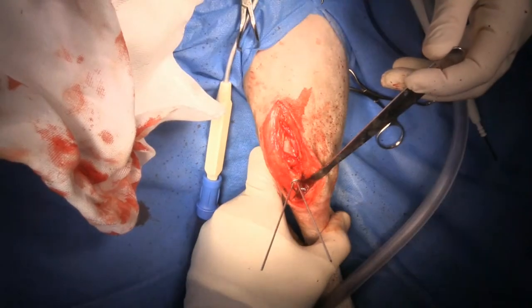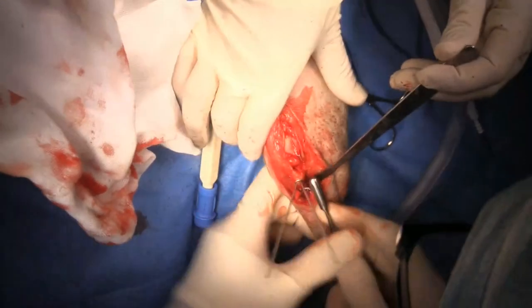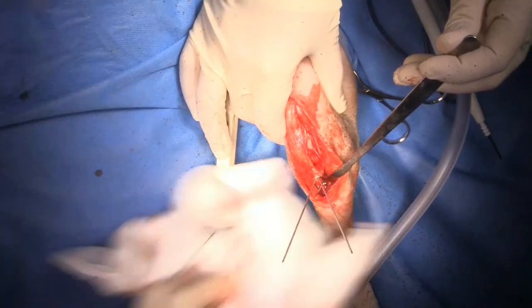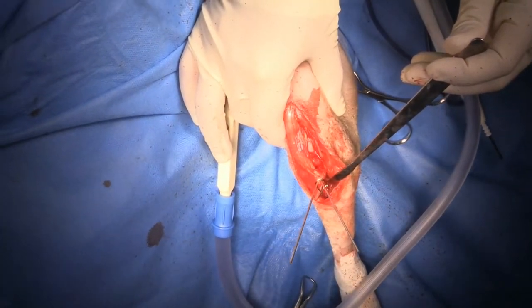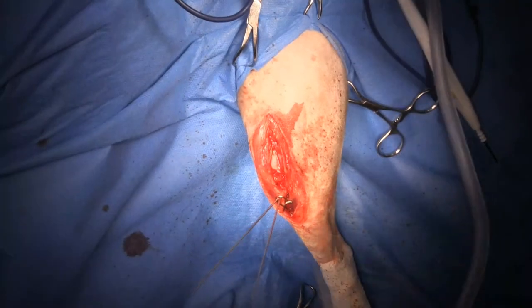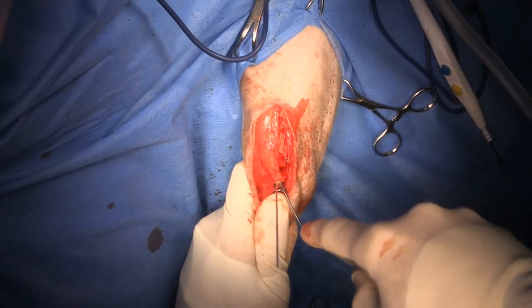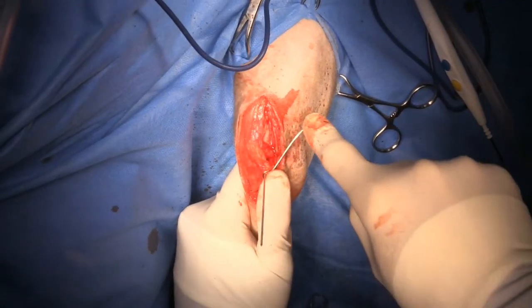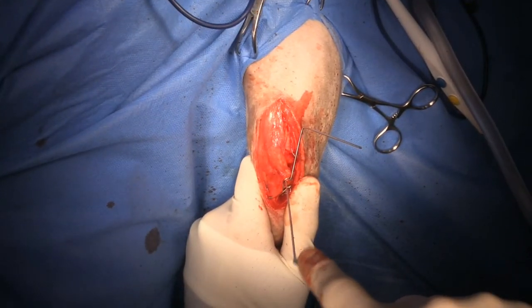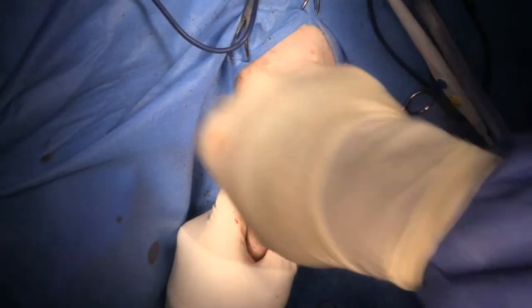I'm going to push the wire down a little bit to bury it underneath the cranial tibial muscle. Then I'll bend my pins over - I use the suction tip, push down in the opposite direction that you'd think, then twist it around so that the bend is going to be closer to the bone.